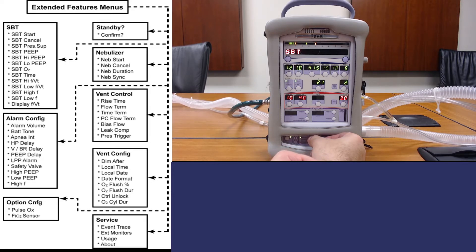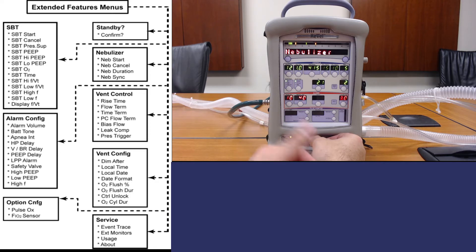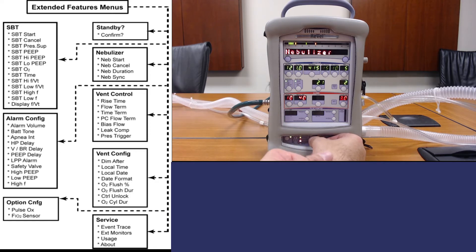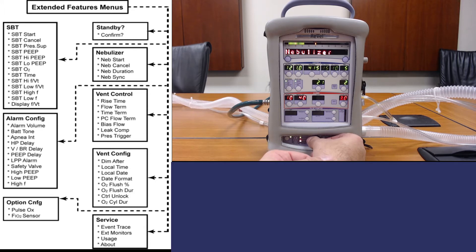For nebulizer, as you can see there's four options: neb start, neb cancel, neb duration, and neb sync.